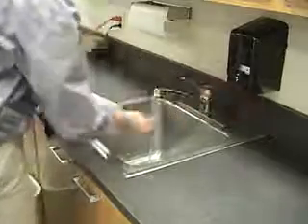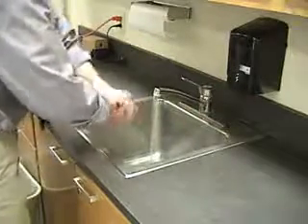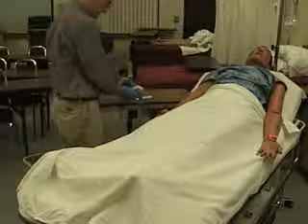As with any procedure, be sure to wash your hands thoroughly before you begin. Be sure you have all the supplies you need before you start the IV. Lay the supplies out where you can easily reach them.